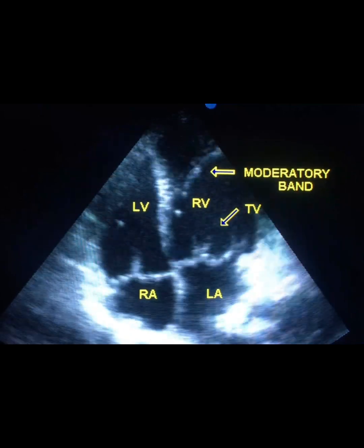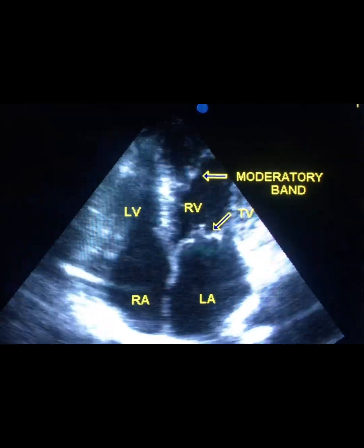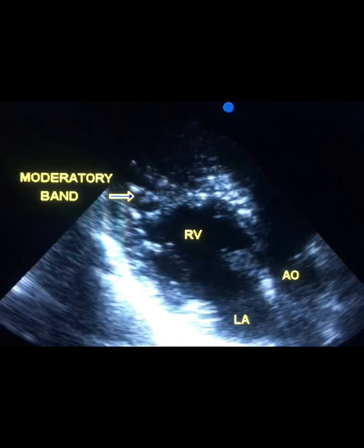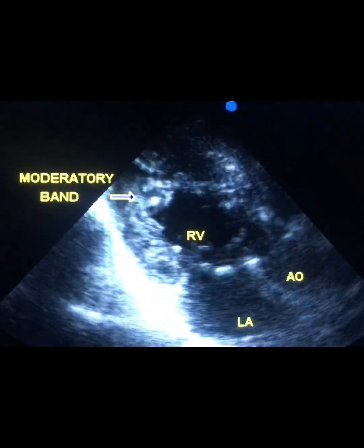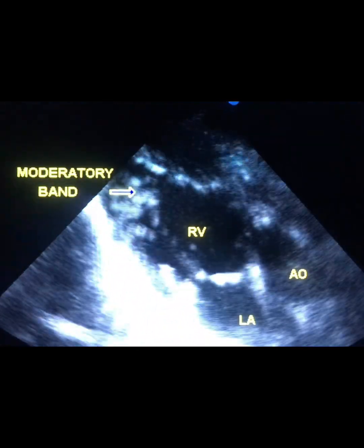Yes, the systemic ventricle is the right ventricle. And in this view, the right ventricle is the systemic ventricle.